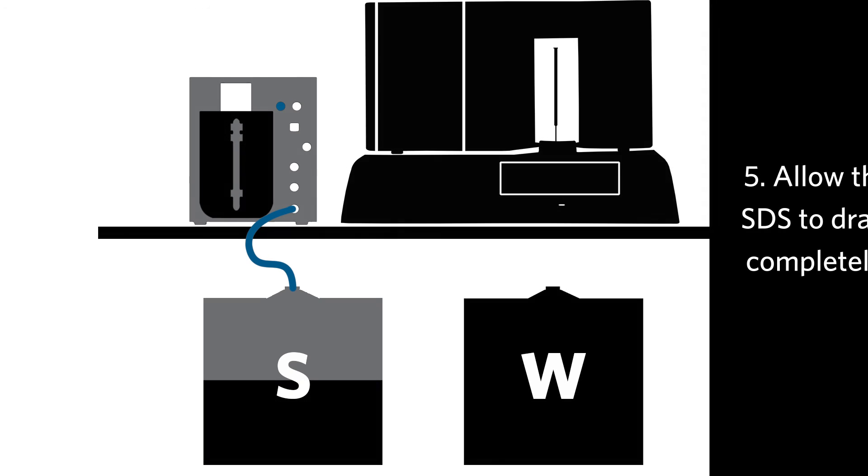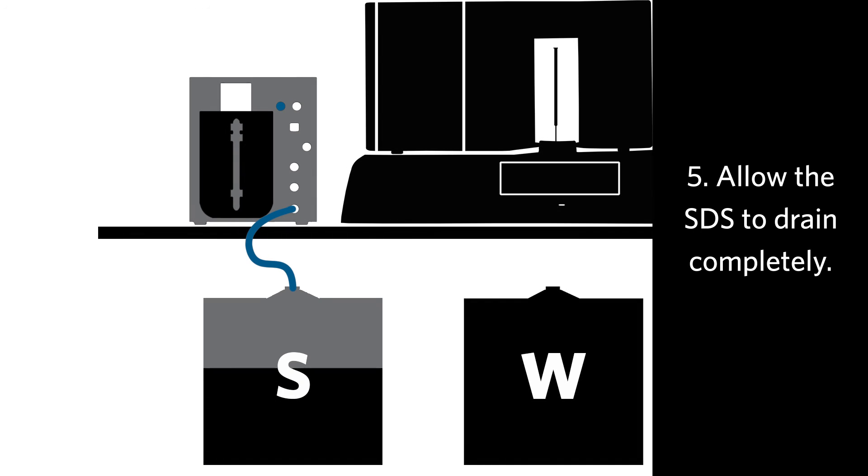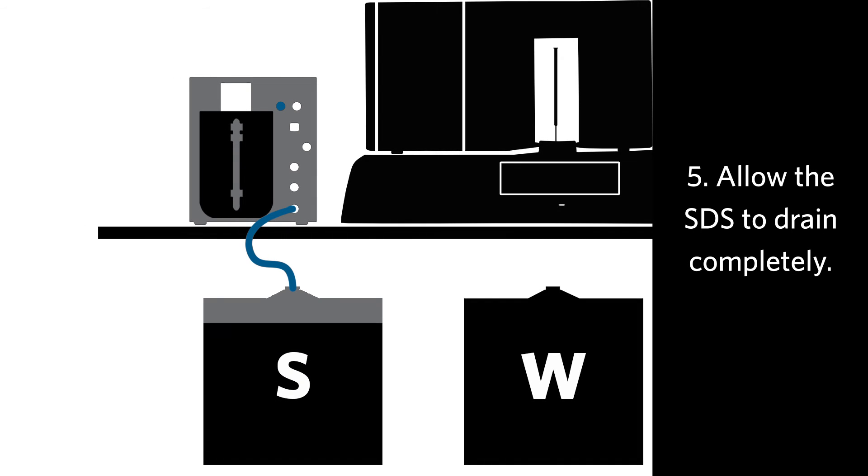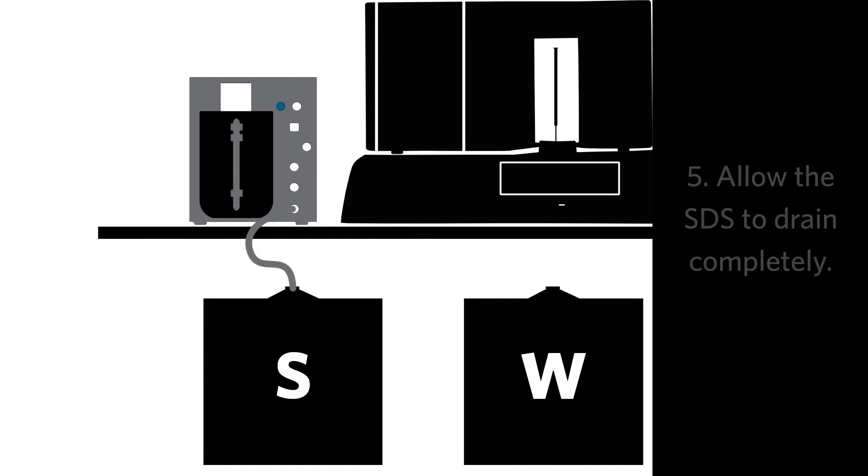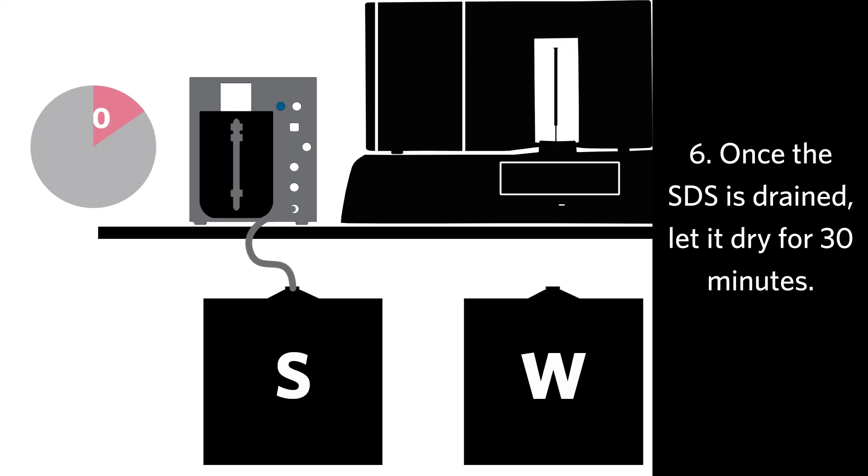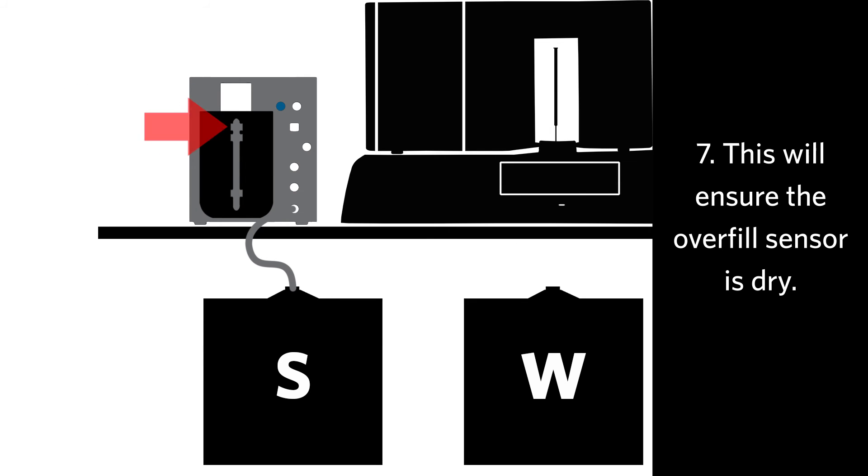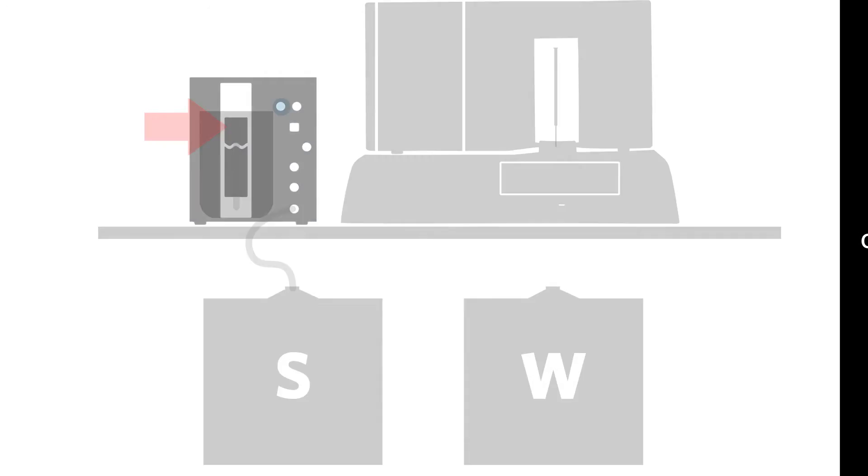Allow the SDS to drain completely. Once it's drained, let it dry for 30 minutes. This will ensure the overfill sensor has been given enough time to dry.